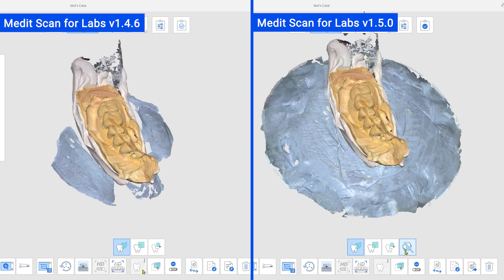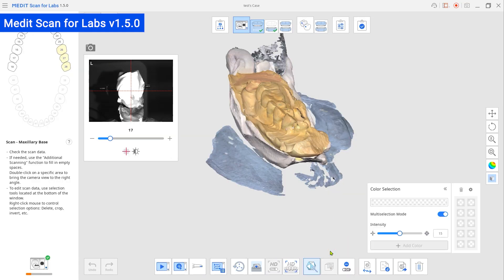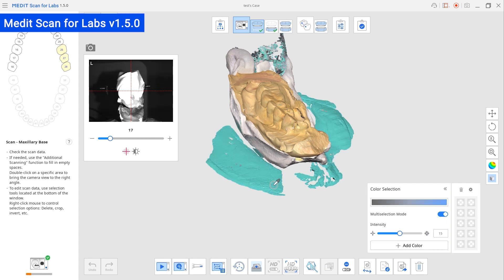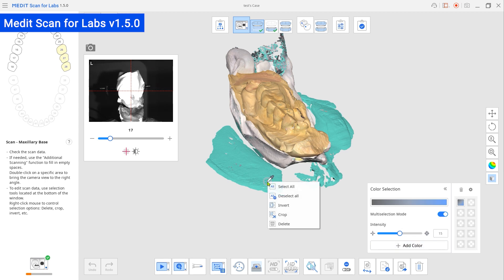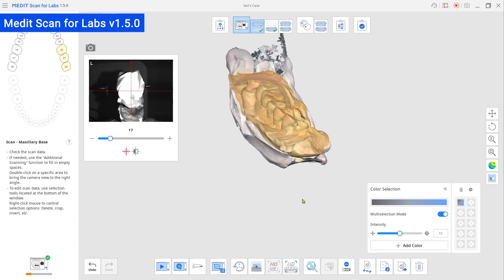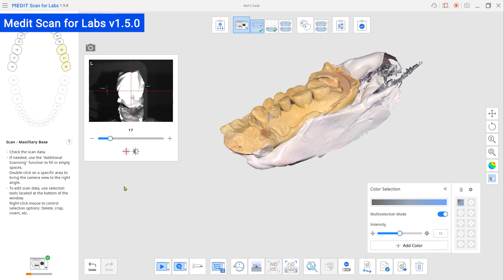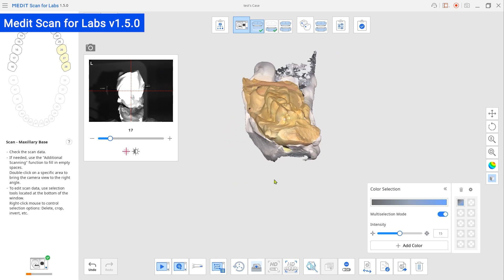Now, with just a single click, you can select all data of the same color and then delete it all at once. You can even pre-register specific colors in the system, and after scanning, the data of that color will be automatically filtered out.